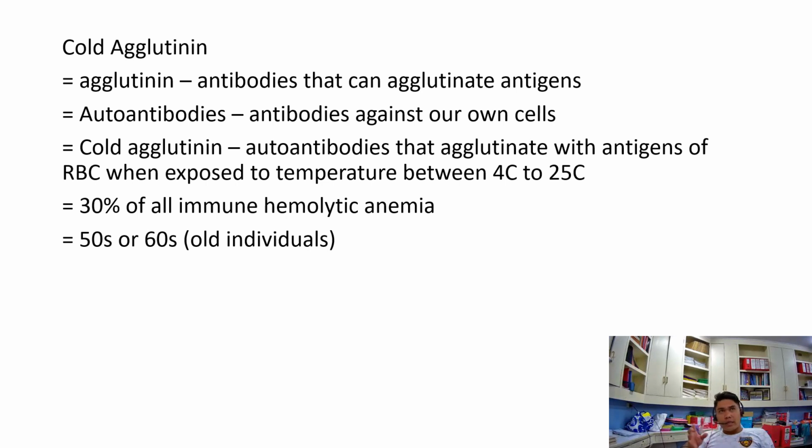At normal body temperature, like 37 degrees Celsius, cold agglutinin usually has no effect. There is no reaction between the autoantibody and the antigen present on the surface of the RBC. So that's for cold agglutinin.